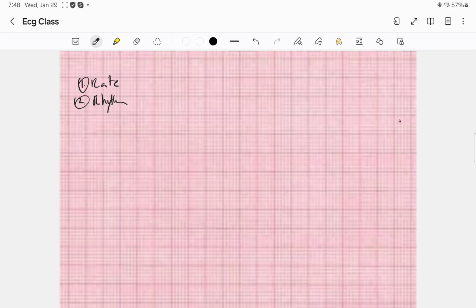So for this part of the series, which is introduction to the ECG, I'm just going to speak about sinus rhythm, right? So how do you know that an ECG is in sinus rhythm? Okay, so first we need to gain an appreciation of what is sinus rhythm.